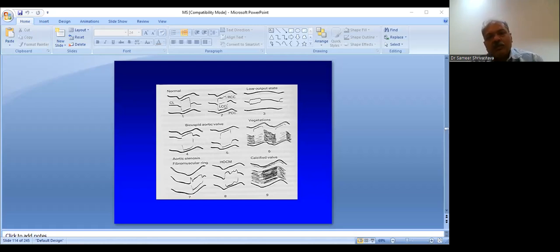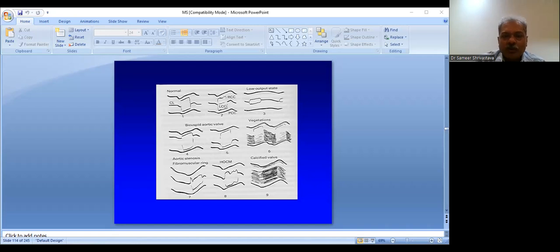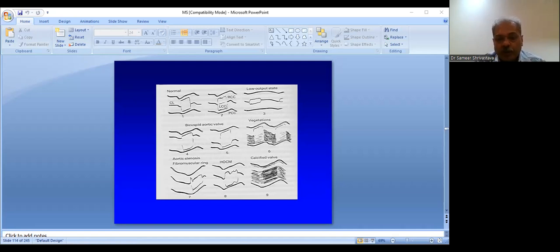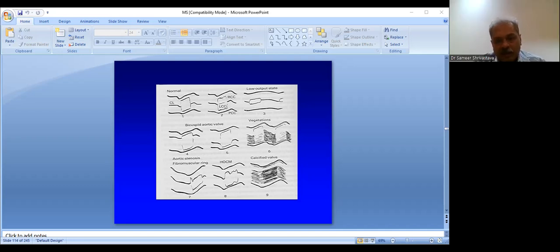You can also see vegetations and shaggy calcifications on M-mode. Fluttering of the aortic valve can occur due to leaflet redundancy — many times the leaflets are long and in high output states this happens. In low cardiac output states, the co-aption opening is narrowed. The eccentric closure line is what you need to document for bicuspid aortic valve.